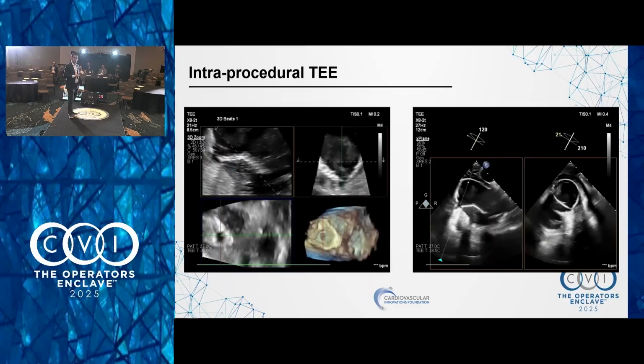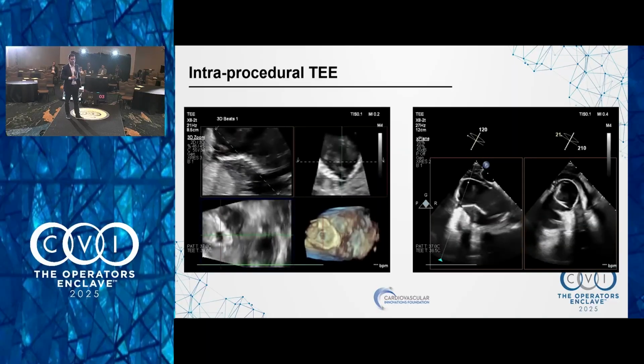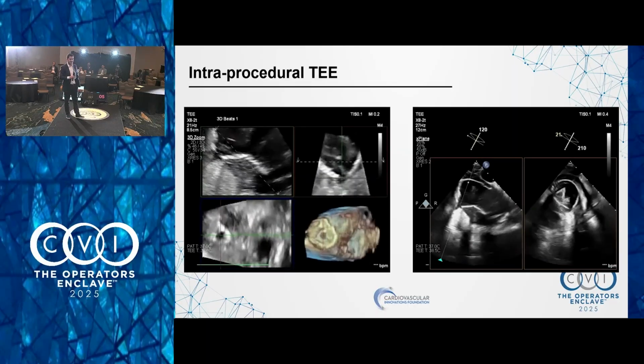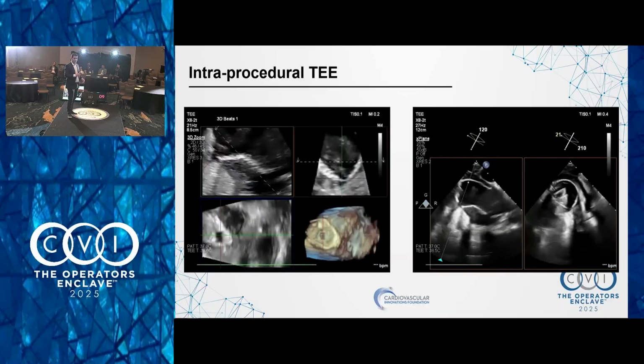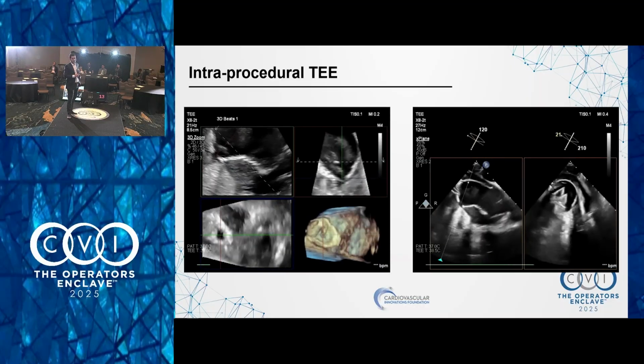So which one would you do first? Would you put your plug in first and then stent? Would you put your stent in first and then plug? Stent. So stent, covered stent, and then put your plug, pull the plug against it. Yeah, but I would keep everything in the right, with the stent in place, and then play around with the pseudo, and then at the end, probably.